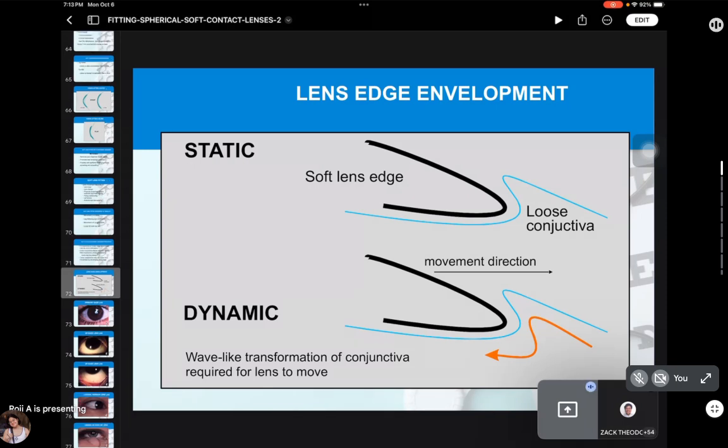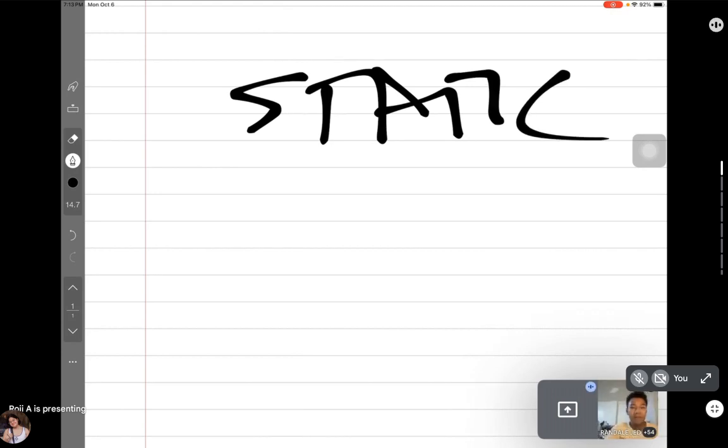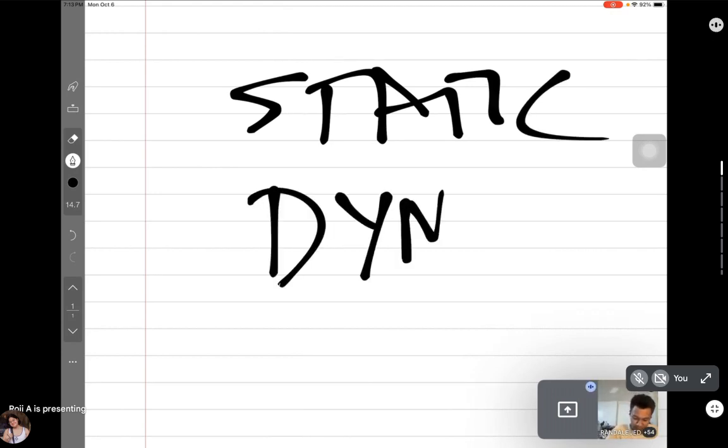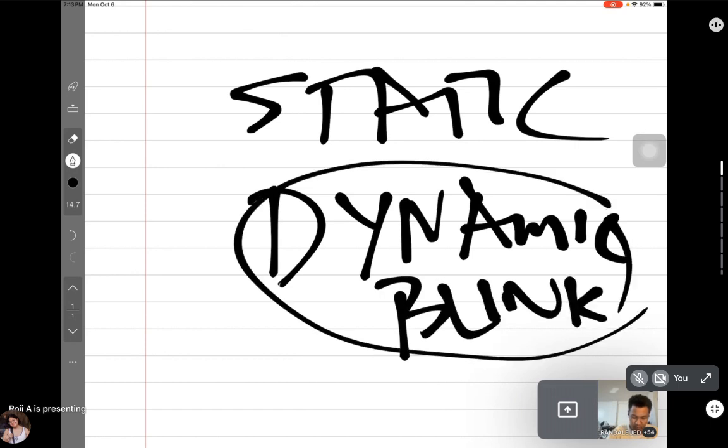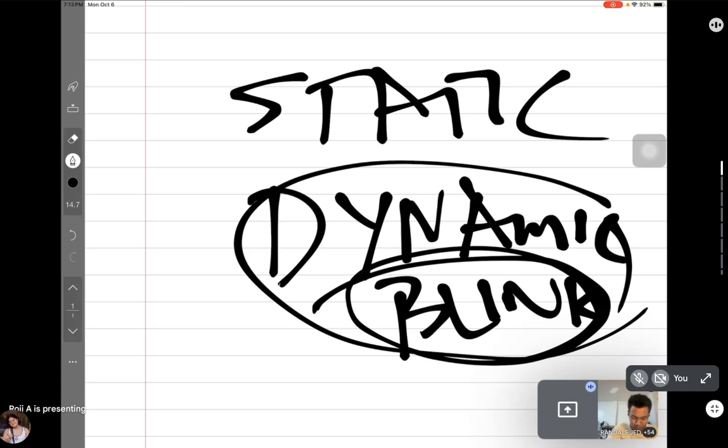So I taught them the difference between dynamic and static in soft contact lenses. Is Randall still there? Yes, Doc, I'm here. Static, dynamic. What's the difference? It's so easy. If it involves blinking, it is dynamic. As long as the patient is not blinking and you are not instructing the patient to blink, you're doing static. How do you do that? Like this. When you ask the patient, look to the left, did you say blink?